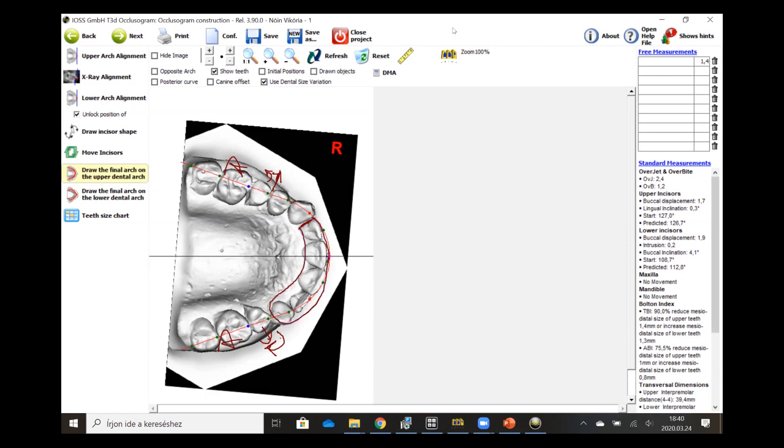And once you have expanded this area, these teeth would probably be here. At any stage, at the beginning or during the movement of the anterior, I would use a rectangular loop to expand and rotate. You are going to create some space here because you are expanding this area. So if you have 1 millimeter of space here, you will close it with an elastic chain. This is also important because we are moving the teeth in this direction.